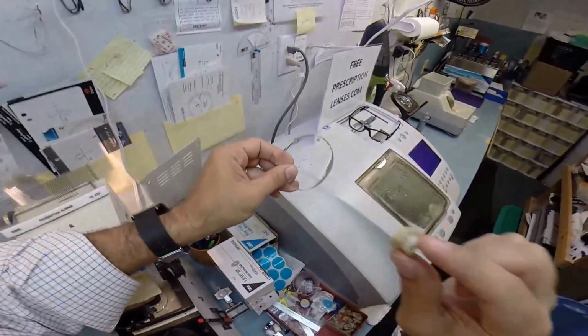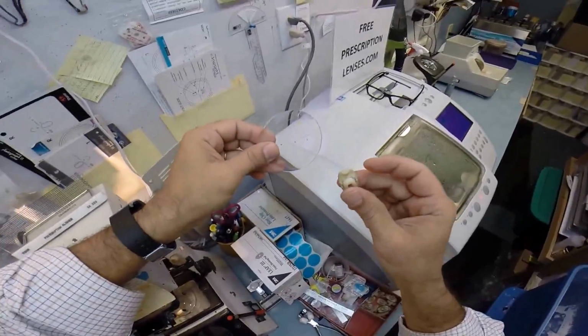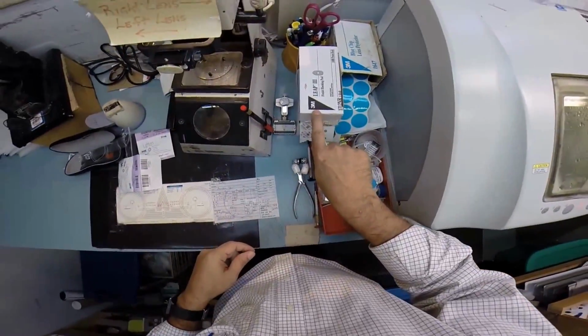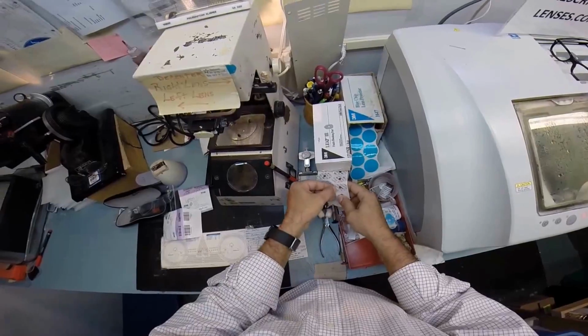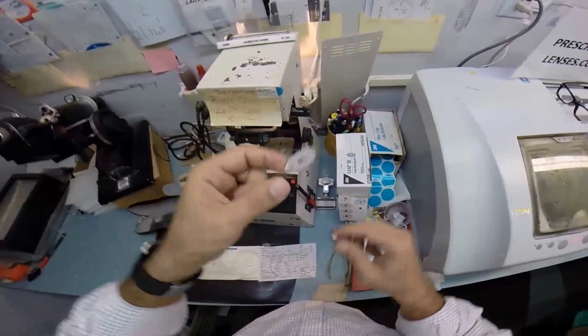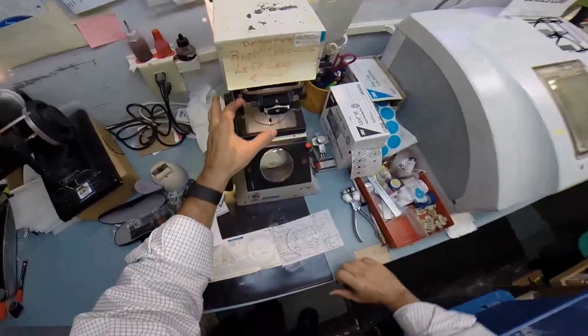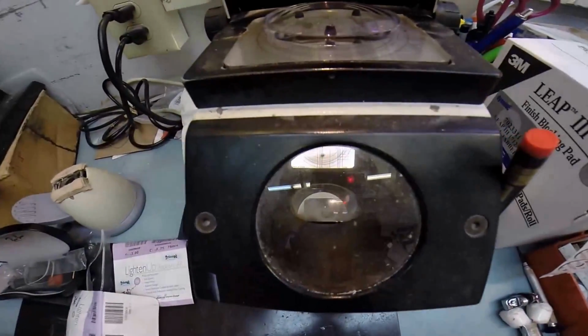But I need to stick this on your lens. So I need a double-sided adhesive sticker. And don't you know, out of Minnesota is 3M. They make a double-sided adhesive sticker. The black side is the sticky side, so I'm going to stick that onto the block. Pull the tape away. And what I'm looking into now is just like the crosshairs of a scope.